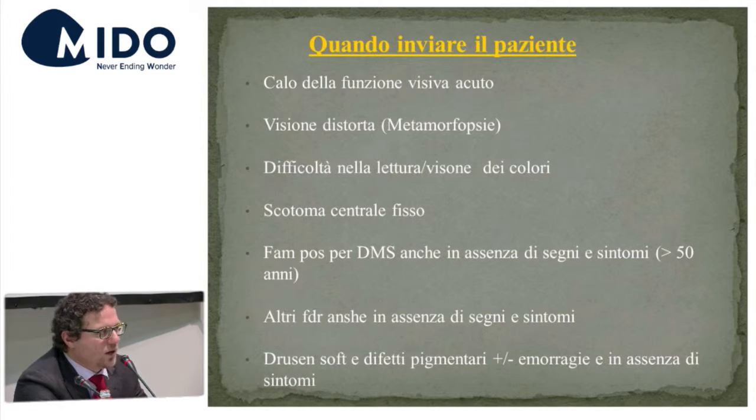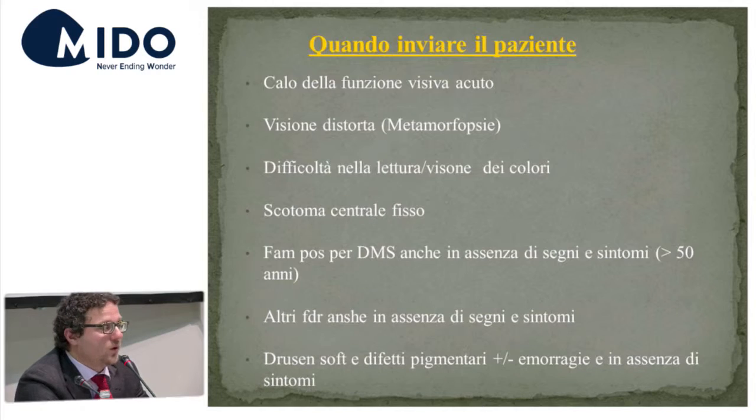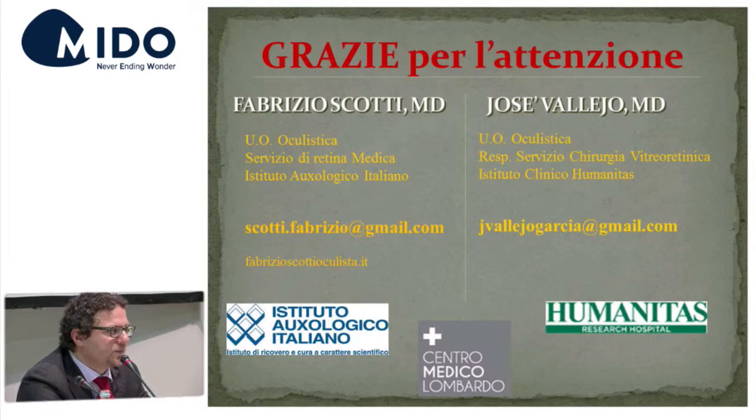When to refer the patient? You refer the patient when you see certain retinal signs I've just shown you, and when they speak about symptoms, distorted vision, and when they report they don't see so well. That's it. This is it.